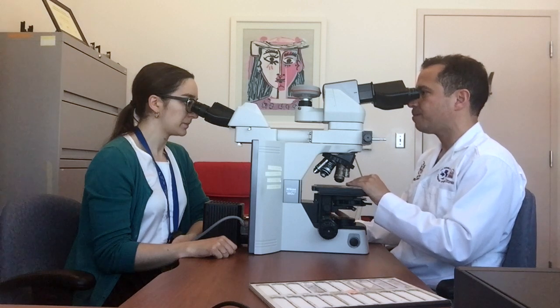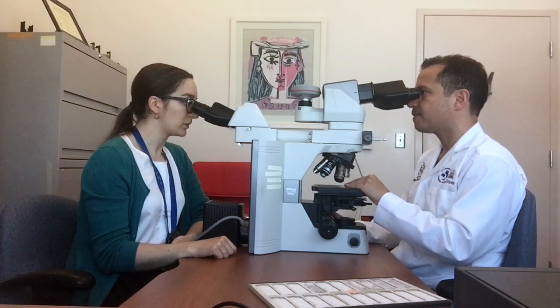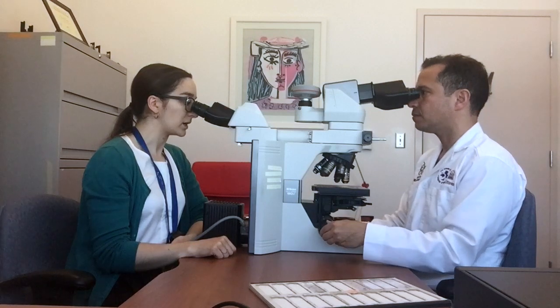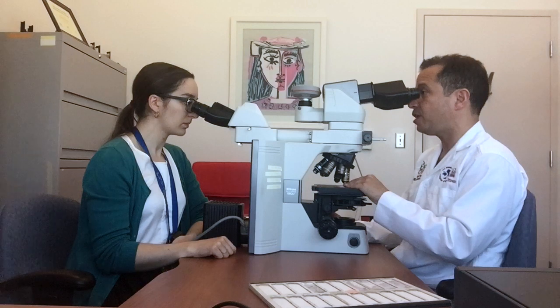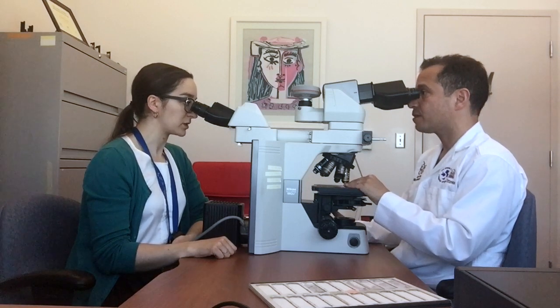Okay, yeah, I agree with you. And what information do you have about the patient? So I know that this is a 75-year-old man, and this biopsy was done for a lung nodule. Okay. And what's your differential here? So you're sure it's an adenocarcinoma? Yep. So is it a primary, a metastatic? Yeah, good question. So both of those are actually in my differential diagnosis.